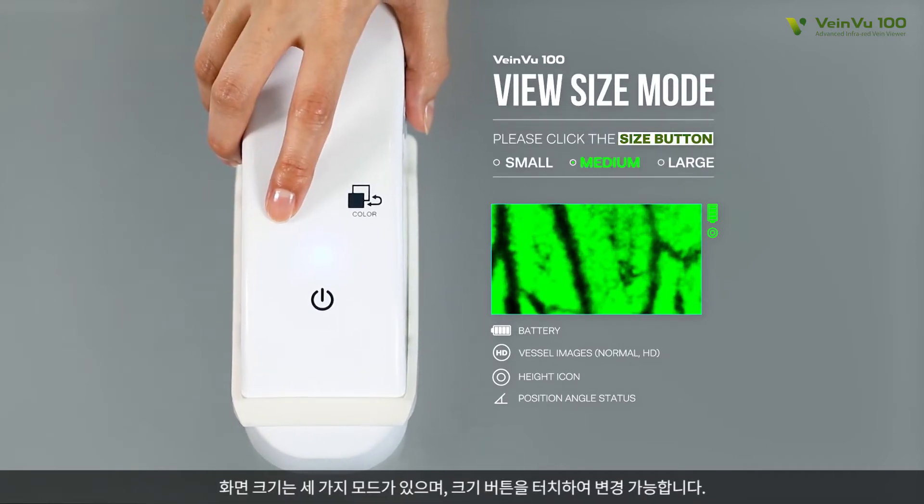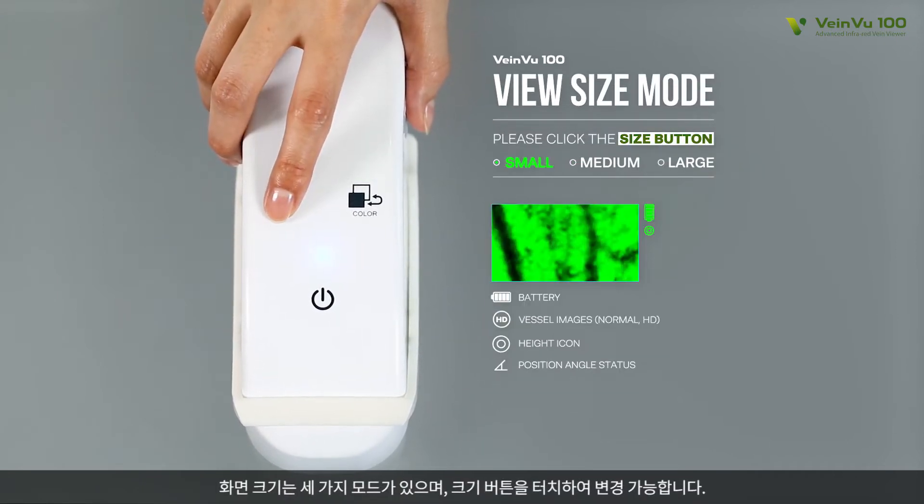VeinView size has three modes. To change a mode, touch the size button.